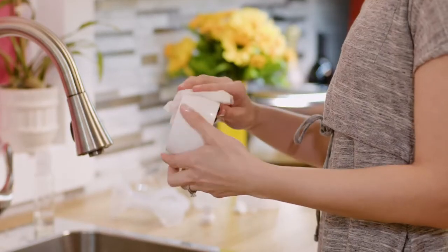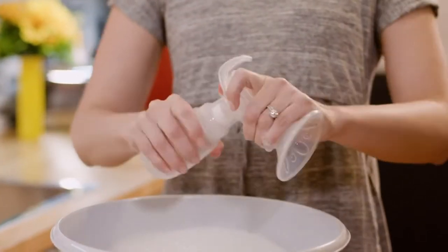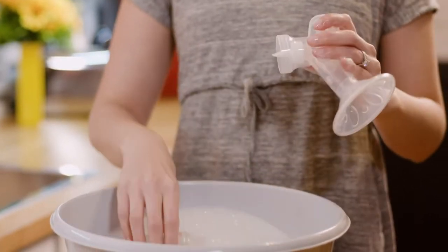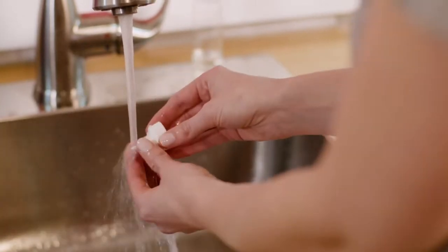Clean the pumping area, including the power switch and countertop, with disinfectant wipes. Take apart the breast pump tubing and separate all the parts that came in contact with the breast or breast milk. Rinse each of those same parts by holding them under running water, avoiding contact with the sink itself.